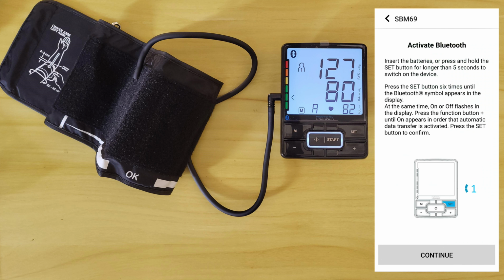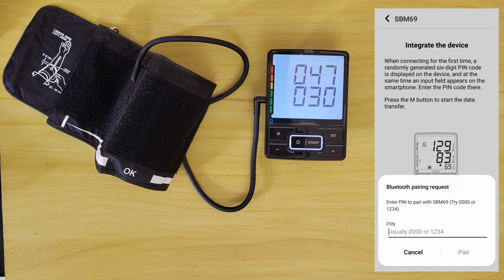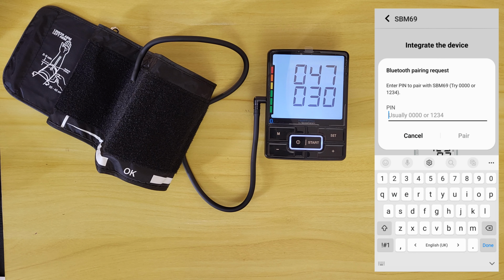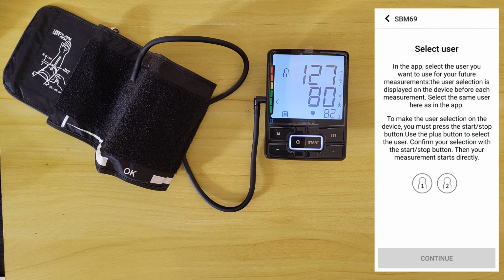Next, activate Bluetooth. Press the set button 6 times until the Bluetooth symbol appears in the display. Okay. Well, there's the Bluetooth, it's flashing. Continue. Integrate the device. Yep, correct. The pin is 047 030, and pair. Solid, it is the Bluetooth.